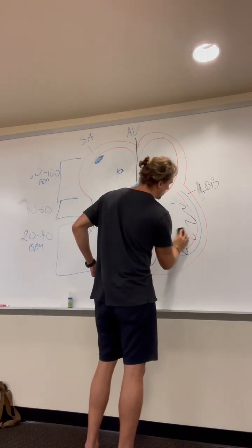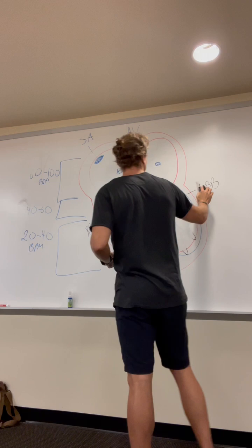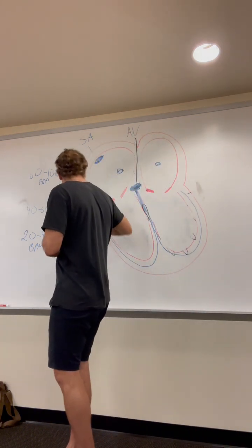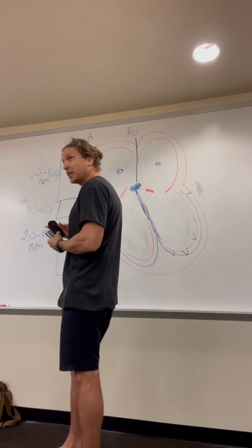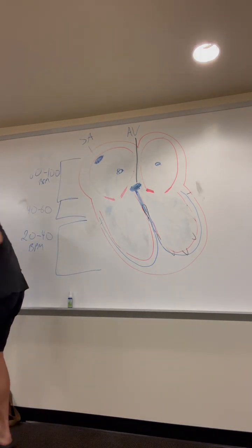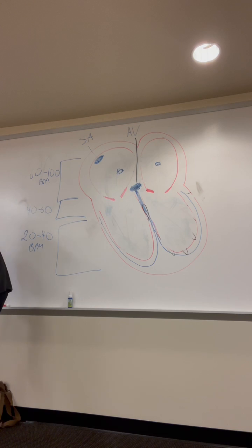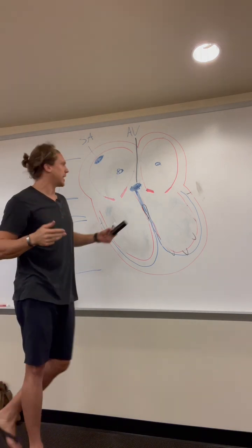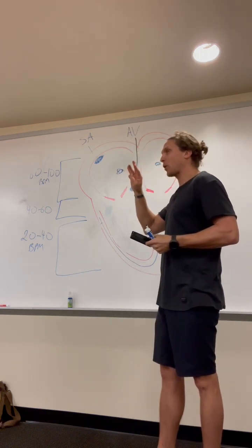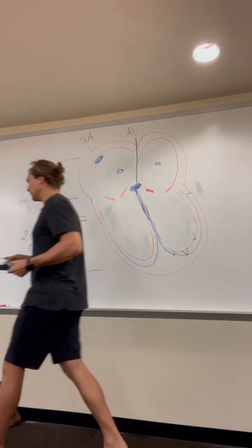All right, so to begin, we'll talk about what a dysrhythmia is. The definition of a dysrhythmia is any alteration in rate, the location of the origin of the heartbeat, regularity, regular or irregular, and an issue with conduction, okay? So like our heart blocks. Those four criteria make it an arrhythmia or dysrhythmia.